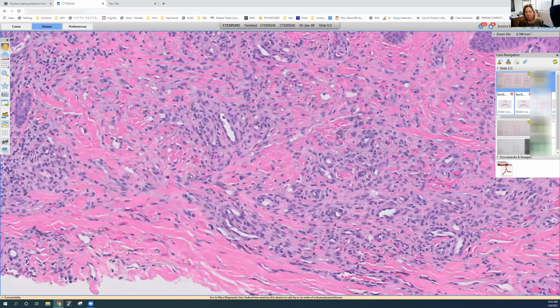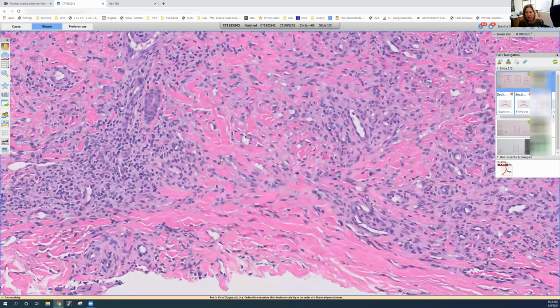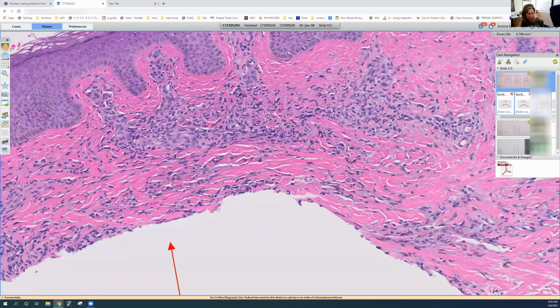You can do a Perls iron stain, and that should light up the hemosiderin in the siderophages. So what's going on here? It almost looks multinodular, with a proliferation of thin-walled vessels with inflammatory cells, red blood cells, siderophages. You could think that this would be an inflamed hemangioma. Why would I show you this covering the virus, protozoa, and histiocytosis chapter?